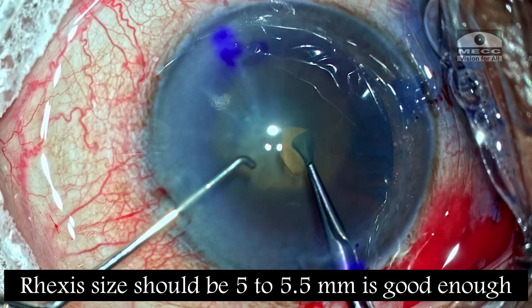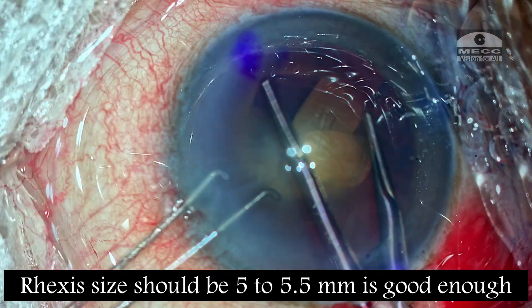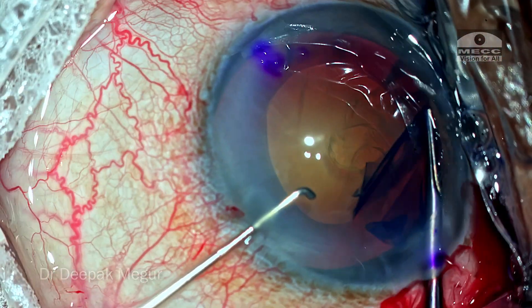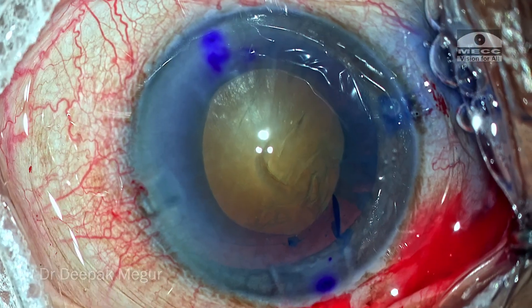As this is a slightly denser cataract, I want the rhexis to be at least around five millimeters or five and a half millimeters. That's the strategy I'm going to use. The rhexis is done now.